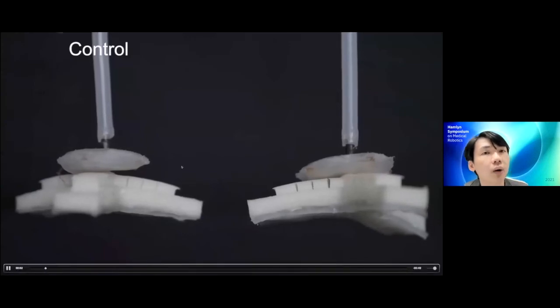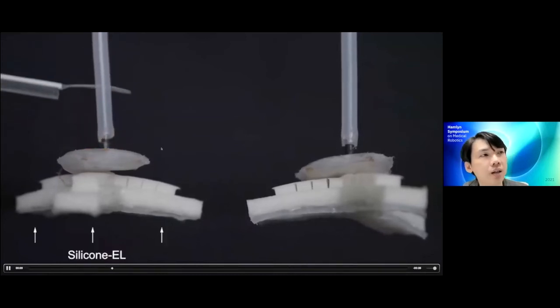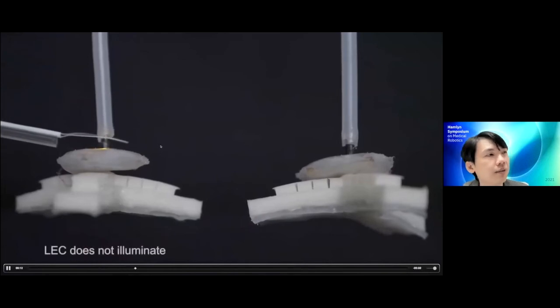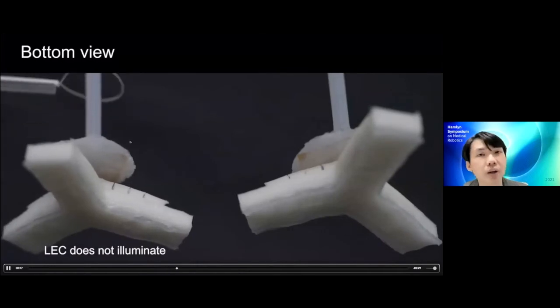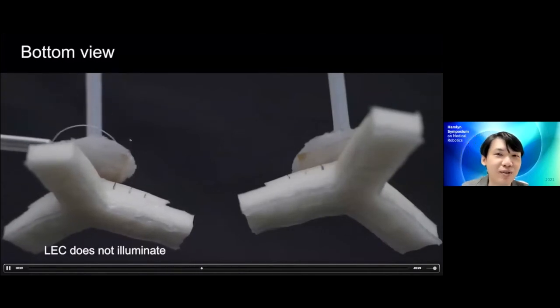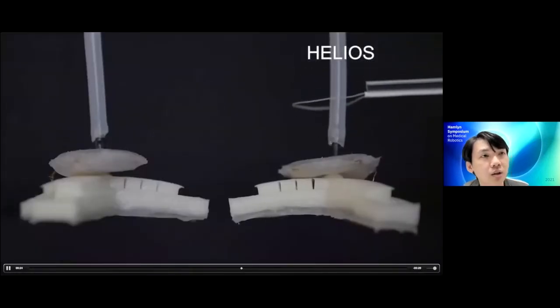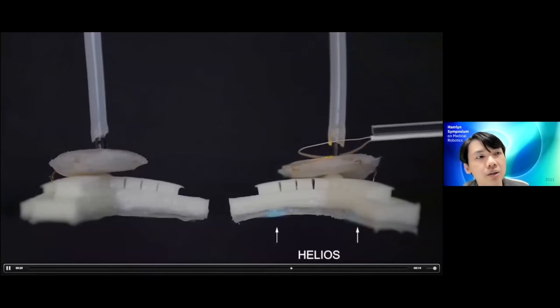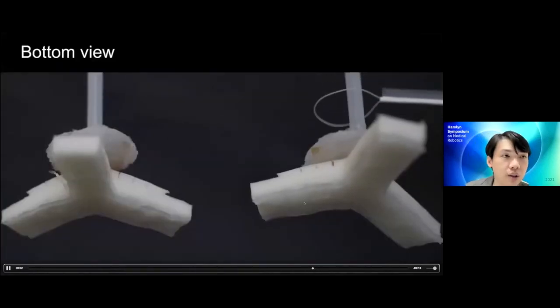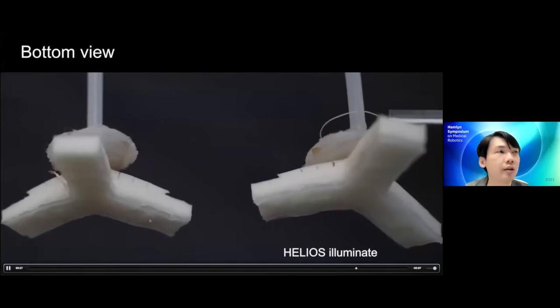So we can also do wireless powering. As Professor Ravinda mentioned, powering devices can be challenging, especially inside the body, which presents very difficult challenges because electromagnetic waves don't like to go into the body, which is why you don't get fried by the Wi-Fi and all this Bluetooth, right? Anyway, we are able to show that because of our material, we can power what we call Helios devices at fairly low voltage, so they actually turn on compared to the control, which doesn't turn on at the same operating voltage.